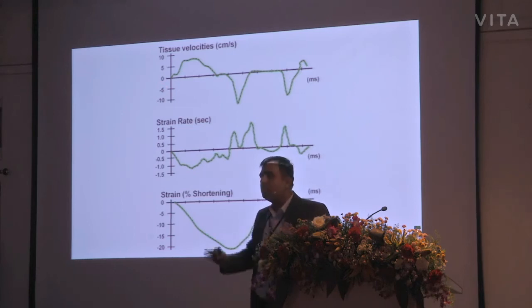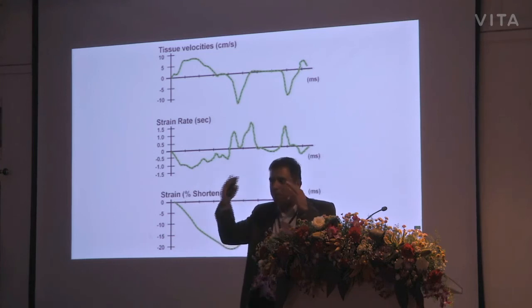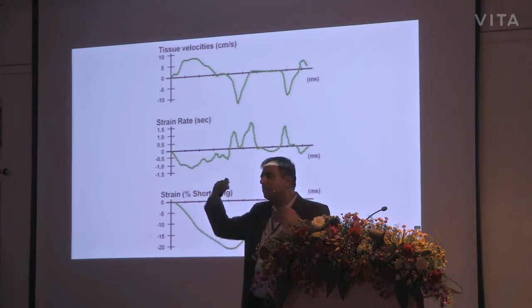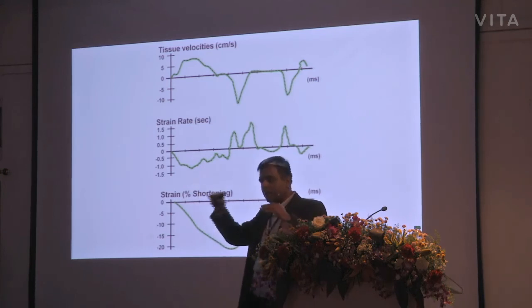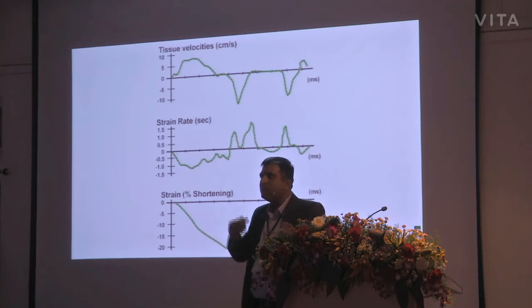No. The baseline is there, 0. You have to visually see where it is so that you keep it in mind. I just want you to know where that 0 line is. Sometimes it's very confusing. It's not marked separately with red. You don't need to mark it, but you need to know visually where it is.